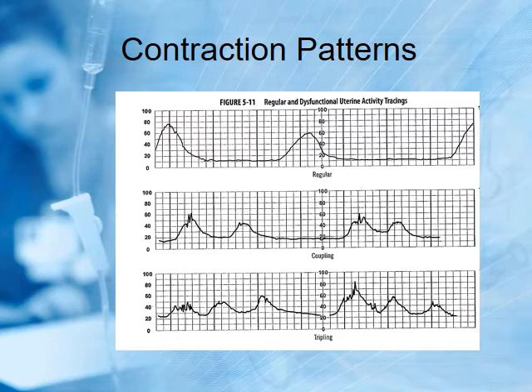So now you're going to see the graph, the chart that we look at in the labor and delivery ward, and hopefully help you better understand this. As I said, in order to determine how often a contraction is happening, how frequent they are, you look from the beginning of one to the beginning of the next. All right. Do you see this heavier black line here? They're a little hard to see, but I think you can. Each of these is a minute apart. Every square is 10 seconds.